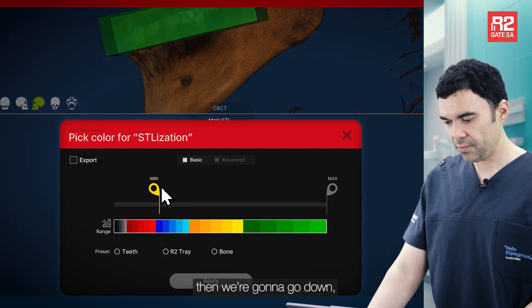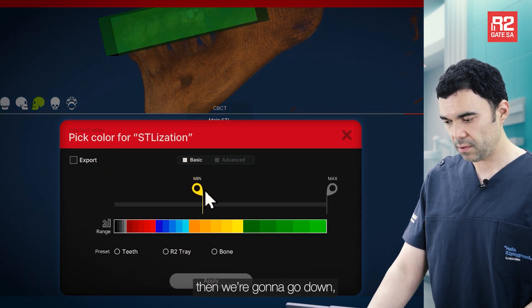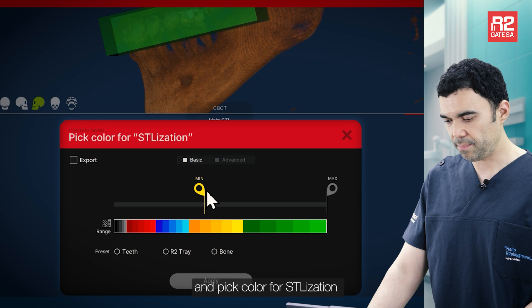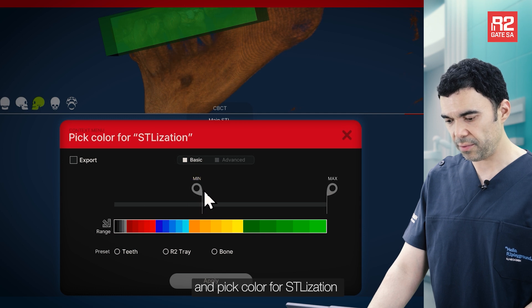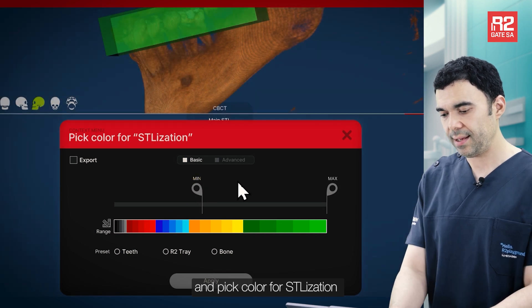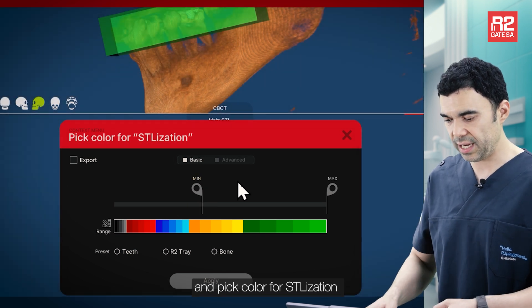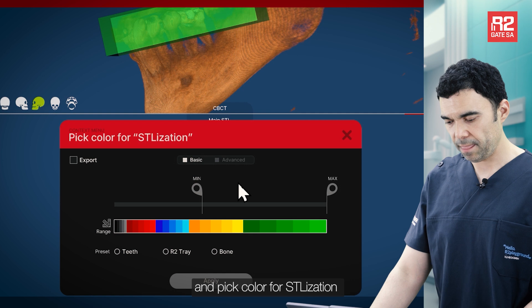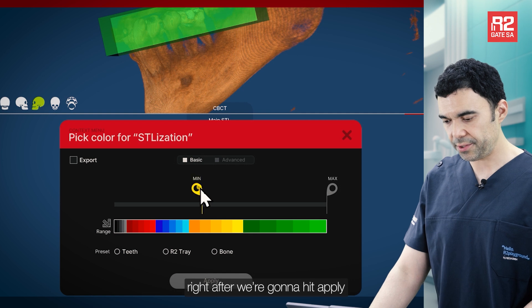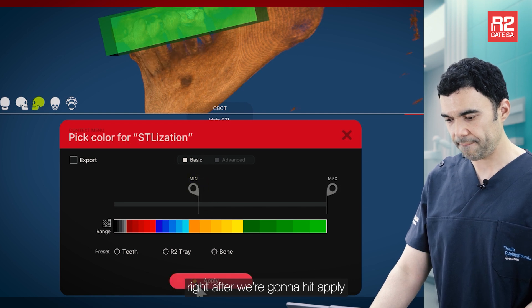Then we are going to go down and hit the bone density from this pick color for STLization. And right after, we are going to hit Apply.